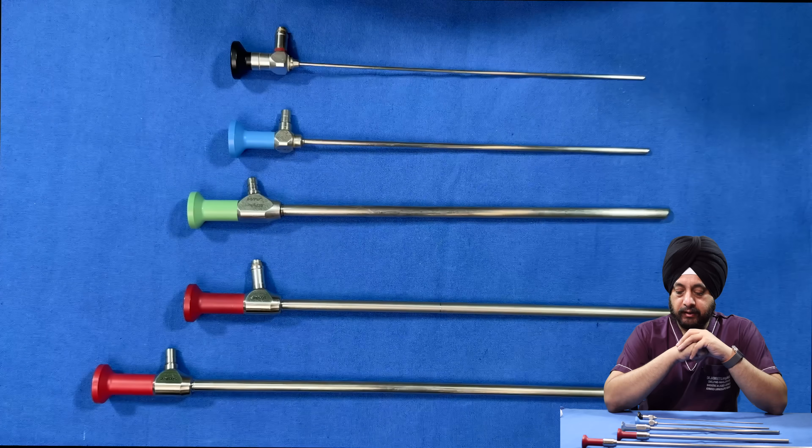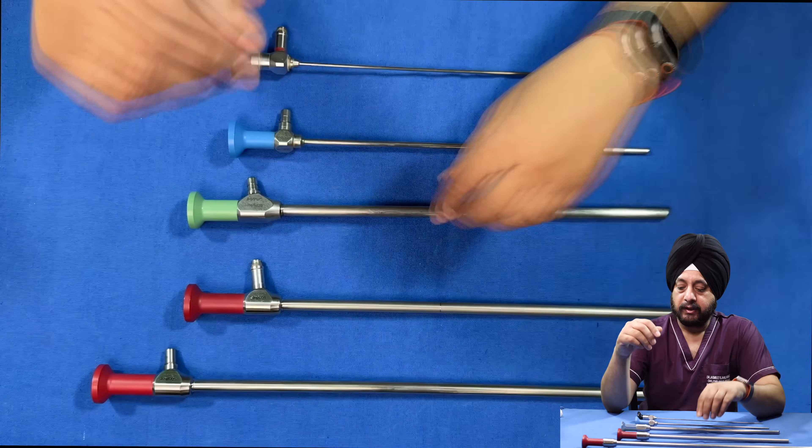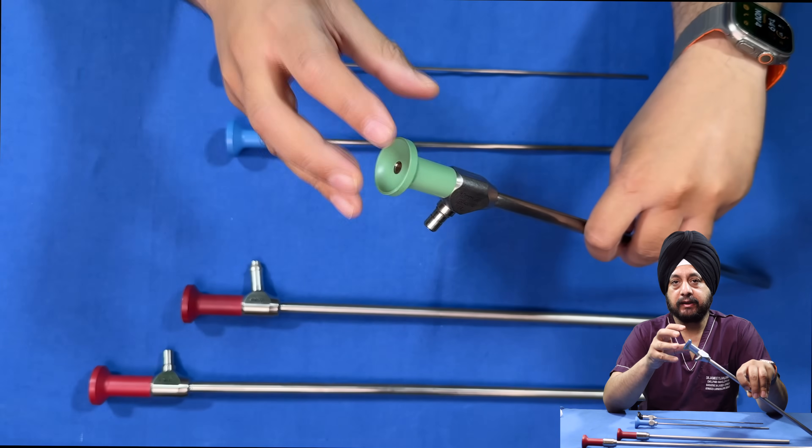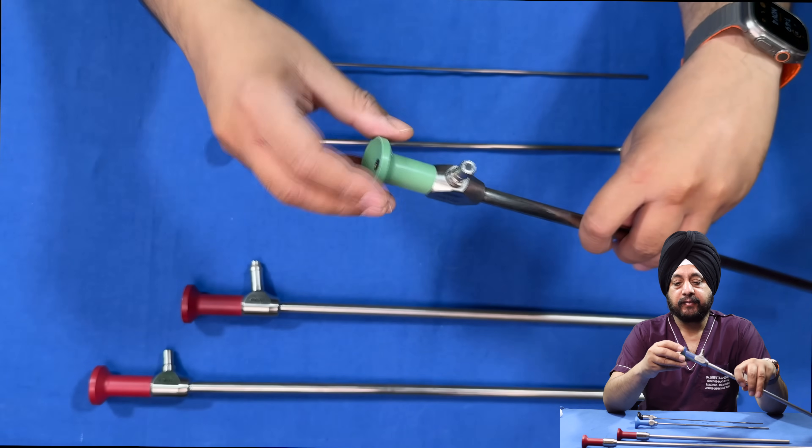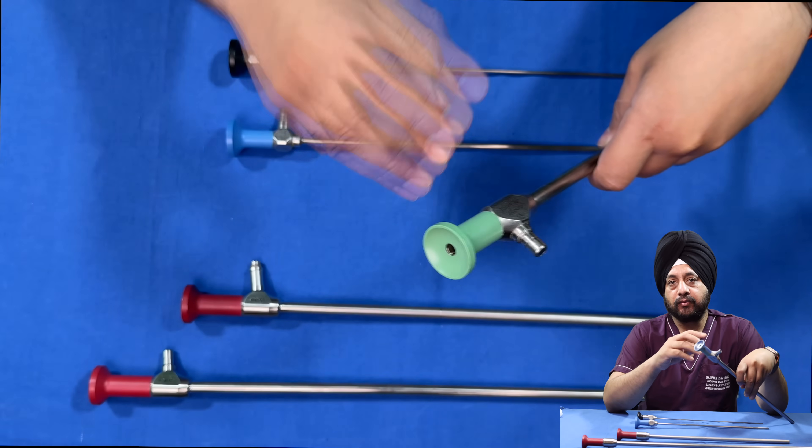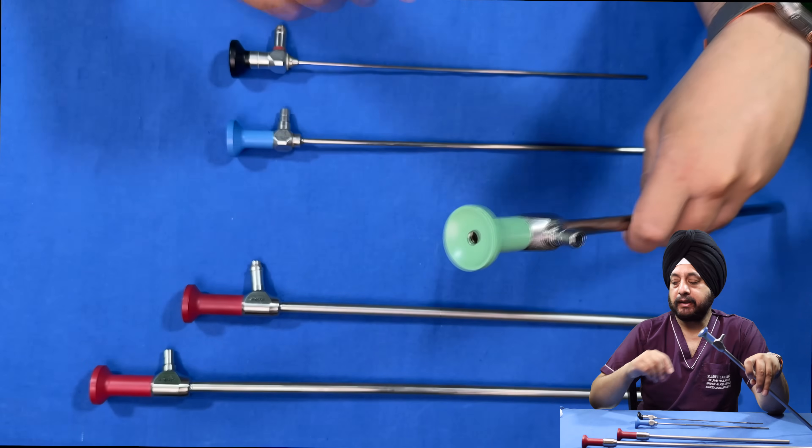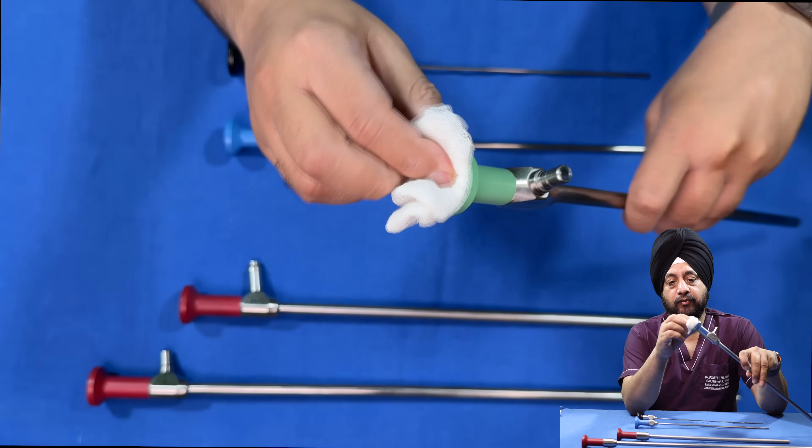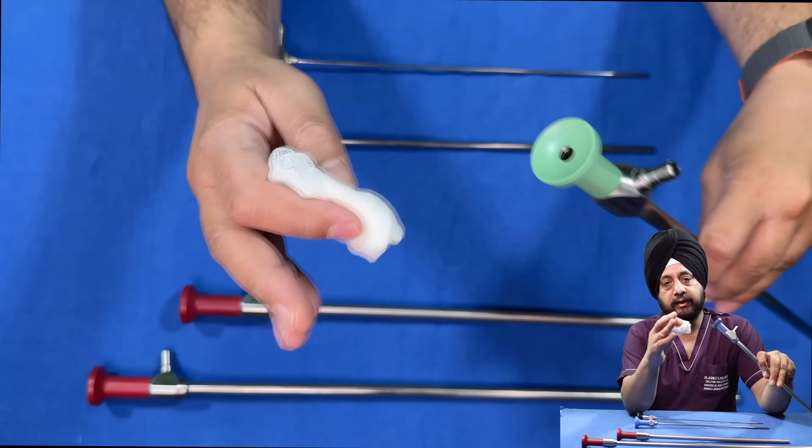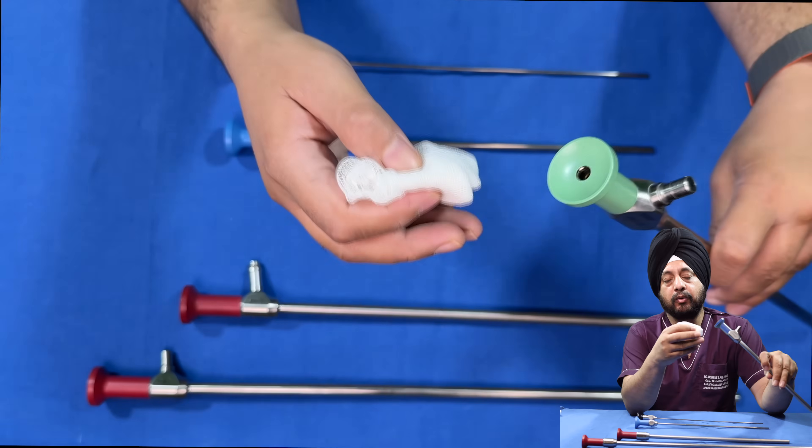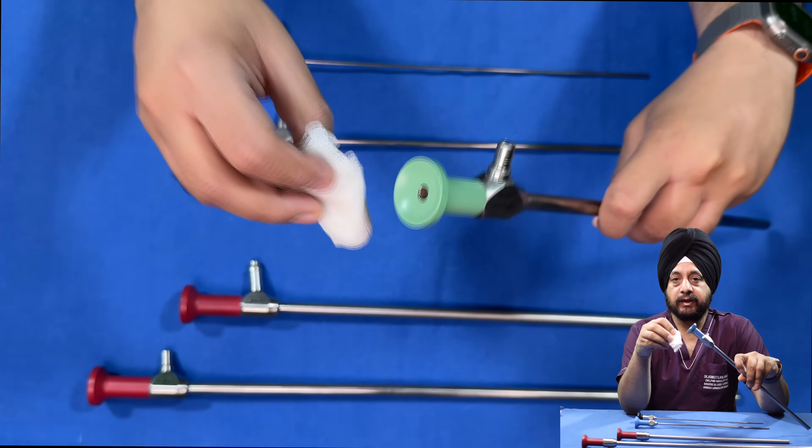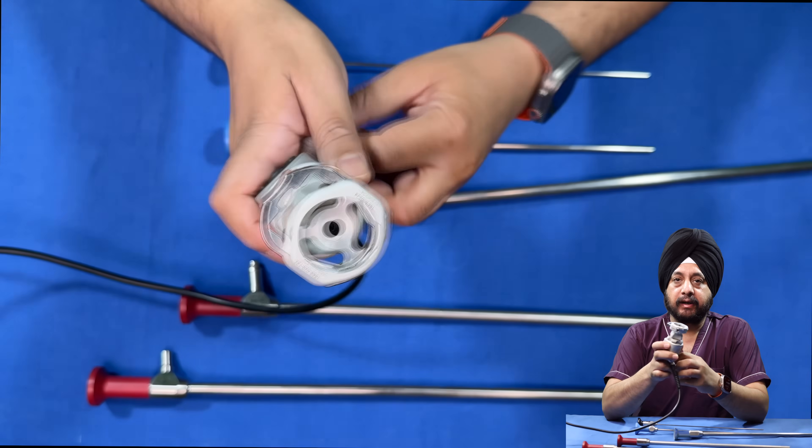The parts of the scope: this is the end where you're going to attach the camera head. This goes into the camera head. Make sure you clean the tip very well before you start the procedure with a dry gauze. Like this, you wipe it off and then reflect light off the tip of the lens to check for impurities, scratches, or moisture.